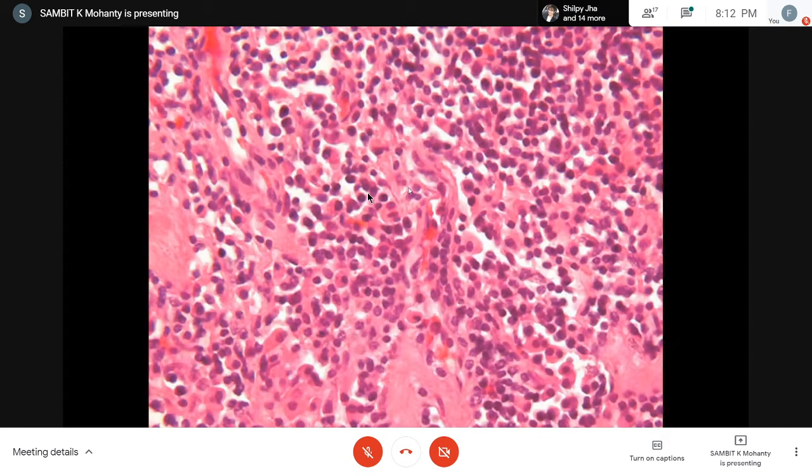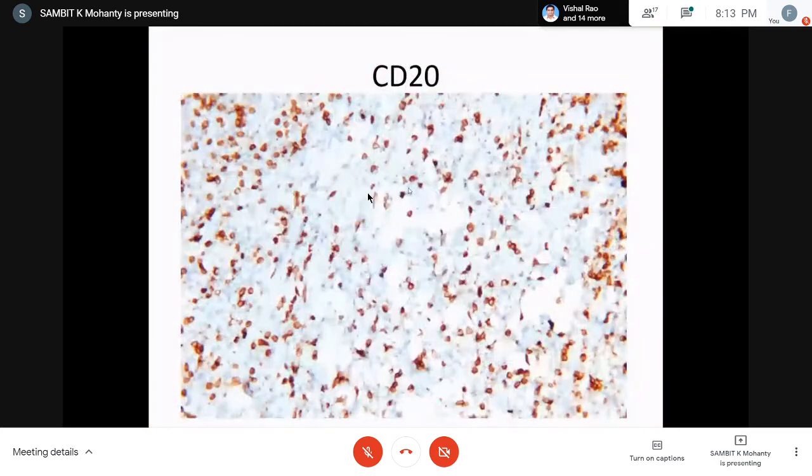How about the cells? Do you want to be a little more specific? Maybe favor something to the neurosurgeon while doing a frozen section? They're kind of eccentric, like the nuclei. Plasmacytoid, sir. Yeah, they look plasmacytoid. Very good. Let's see the next one.